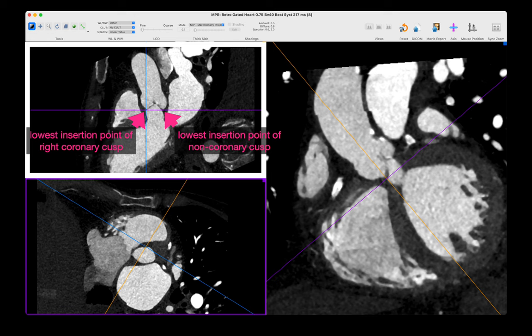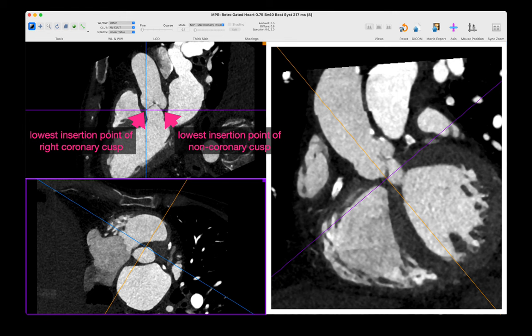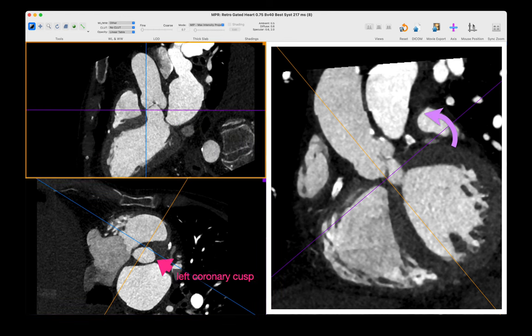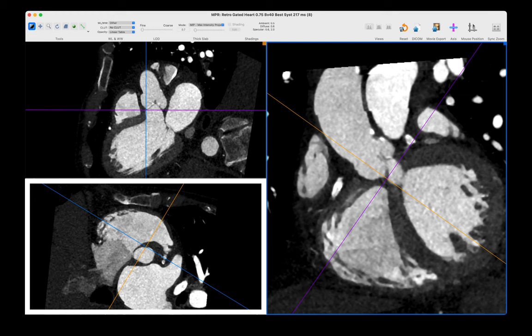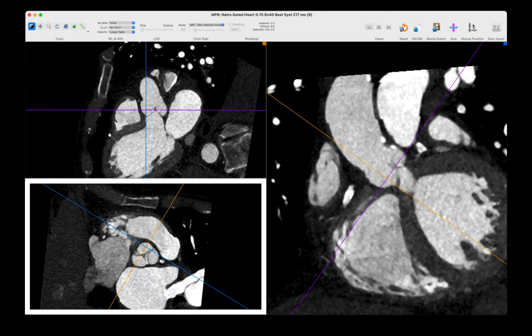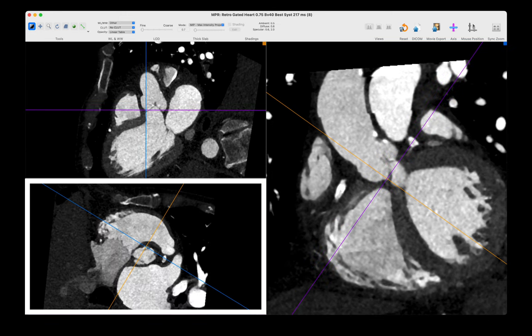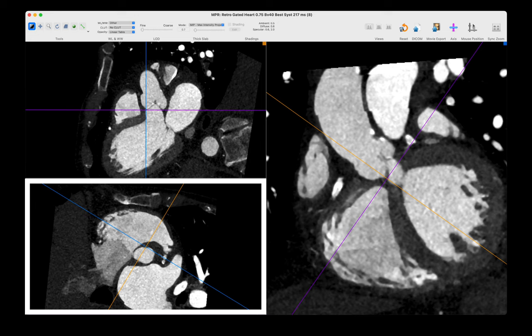Now go back to your coronal plane and rotate the crosshairs until the lowest insertion point of the left coronary cusp just barely appears in your former axial image, which gives you your true short axis view through the aortic valve plane. Double check that you are true by scrolling on your short axis view — if you're really in a true aortic valve plane, all three leaflets should disappear on the same image slice.